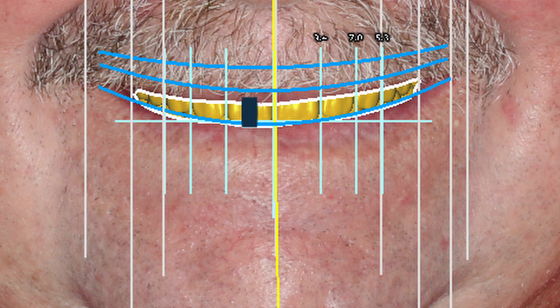And with those superimposed, we know where the teeth, gums, and jaw are in relation to the resting lips when the patient is just talking and being normal. Now, once we have it all lined up, from there we can make a digital 3D denture lining up the new central incisors around 3 millimeters below the resting lip line, and also with a complete thickness of about 15 millimeters along the whole upper arch.